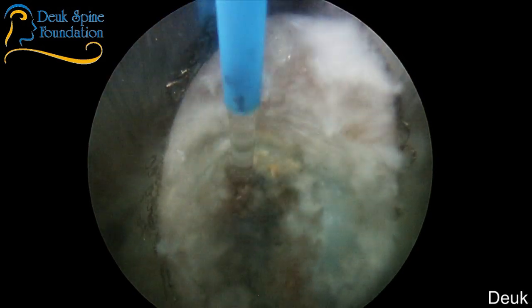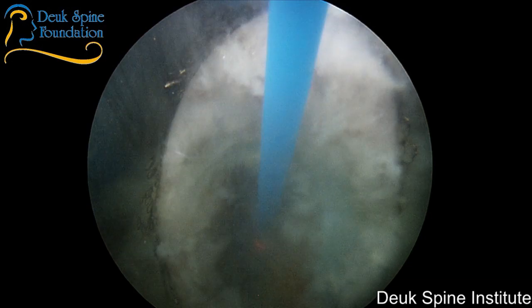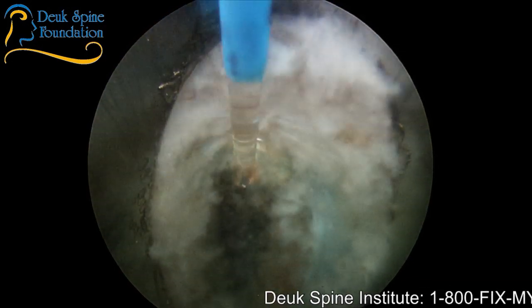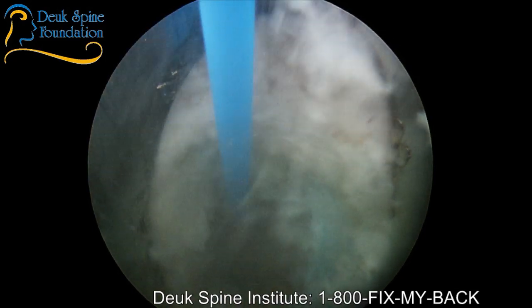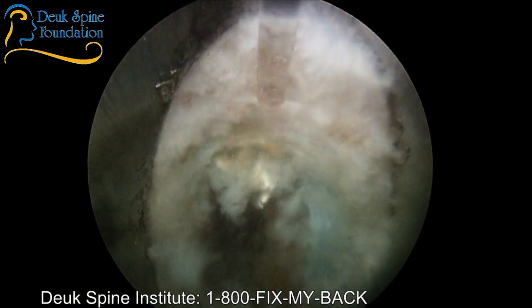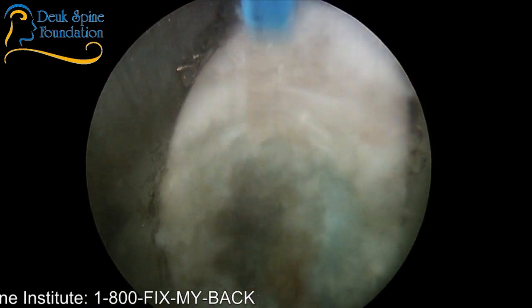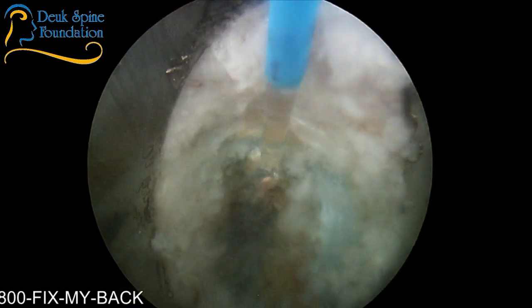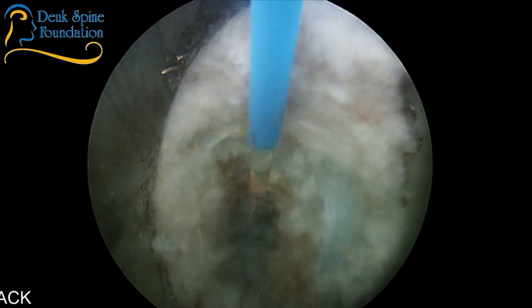All right, so after this we're going to go to L5-S1. You may remember L5-S1 has a spondylolisthesis, almost grade 2. And he has a pars defect there where the bone has been cracked and slipping. Yeah, there's another piece of herniation right there. And this right here is the posterior longitudinal ligament.